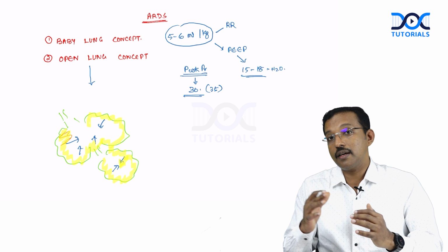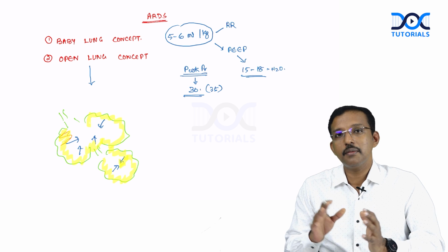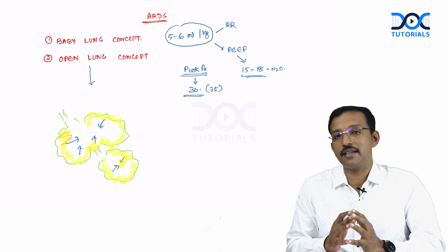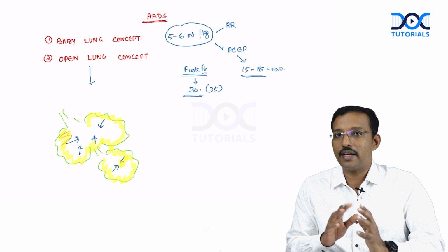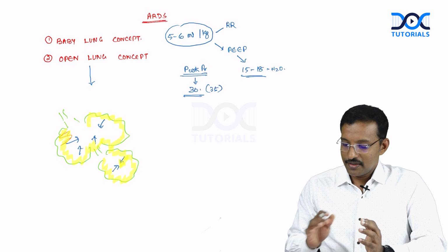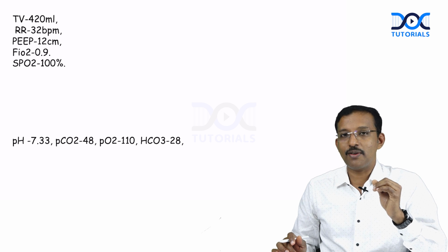Apart from that, there are many other concepts which are used in ventilating a patient with ARDS, but from an MCQ point of view, for a postgraduate or entrance examination point of view, these are the two areas which you should take into consideration. Okay. So with this, we will go back to our question and see whether we can solve this.